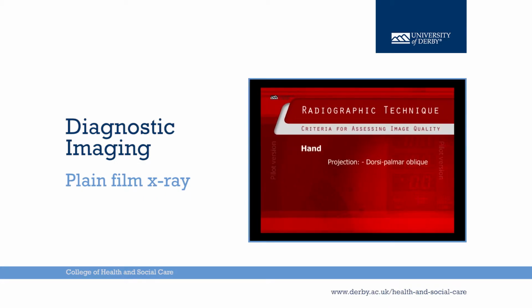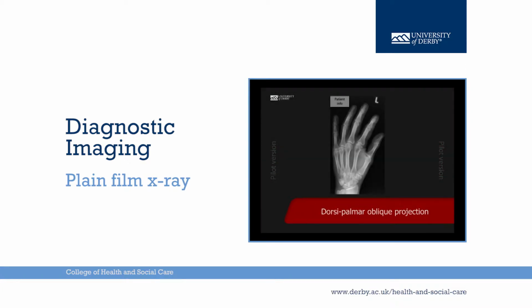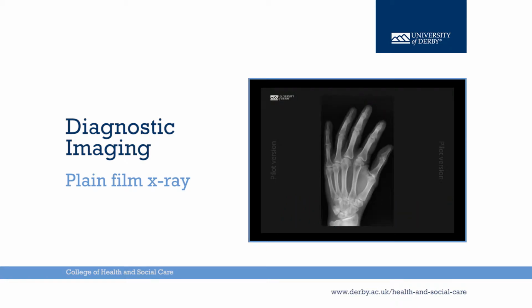The following criteria should be used when checking image quality of a dorsi-palmar oblique hand projection. The image is checked for correct patient identification and annotation. The region of interest includes the distal radius and ulna, the carpal bones, metacarpals, all distal phalanges and soft tissue outlines.